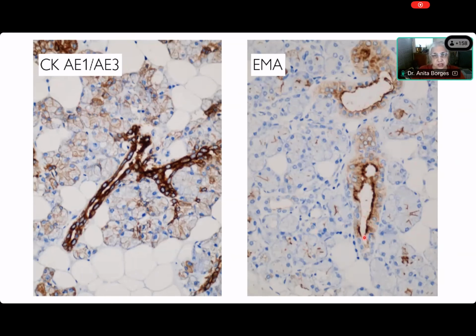And that's why I like to think of the myoepithelial cell as the Cinderella cell. It is a cell that, as Somik said very well, you cannot or do not notice under normal conditions, but it becomes obvious under conditions of neoplasia. It forms the outer layer of cells in normal intercalated ducts and normal acini of the salivary gland. It is not seen in the striated duct. You do see a second layer, but those are basal cells in the striated duct and in the excretory duct.